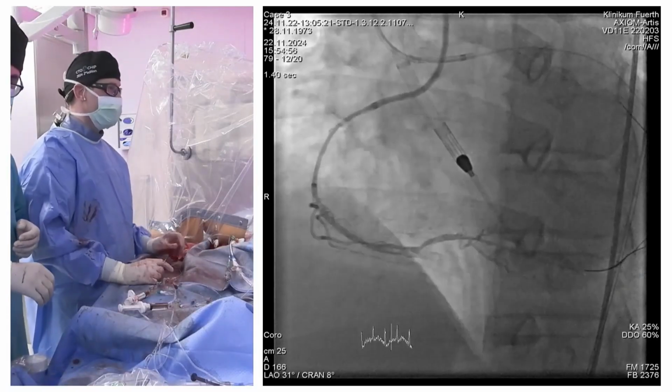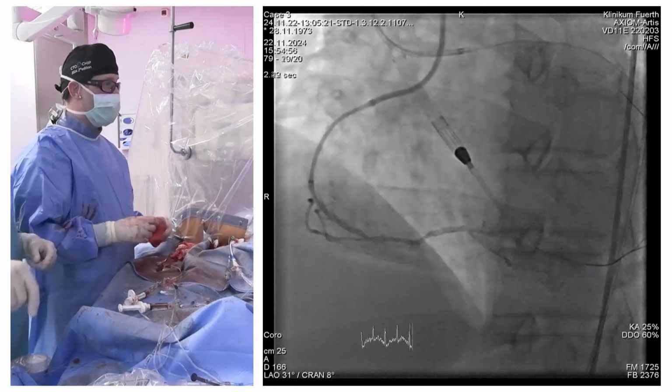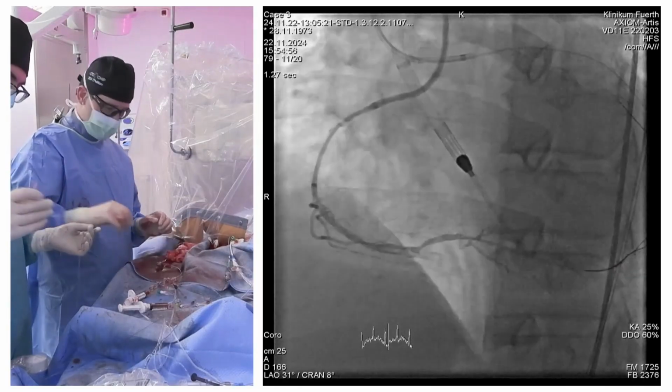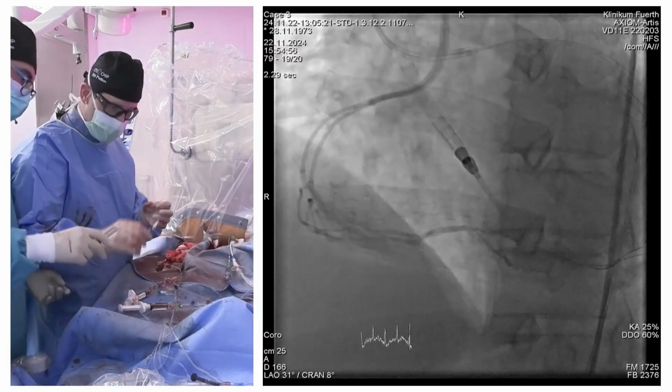I'll be a little bit provocative over here. Have you read the guidelines, the new ones? Yeah, I have to stand again about this whole part. So yeah, I also agree with you that I would also DCB this, but if you let me rotablate the whole thing up front, I might do that.